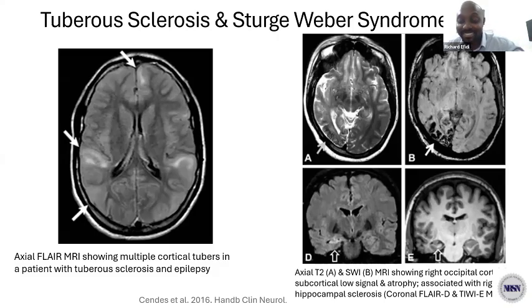The other modality that is also good is radionuclear functional imaging, but radionuclear involves radiation and is invasive, with injections and all that, so we want to avoid all of that in children. That is why arterial spin labeling imaging is the diagnostic modality of choice in children, especially where MRI fails to identify the epileptogenic lesion.